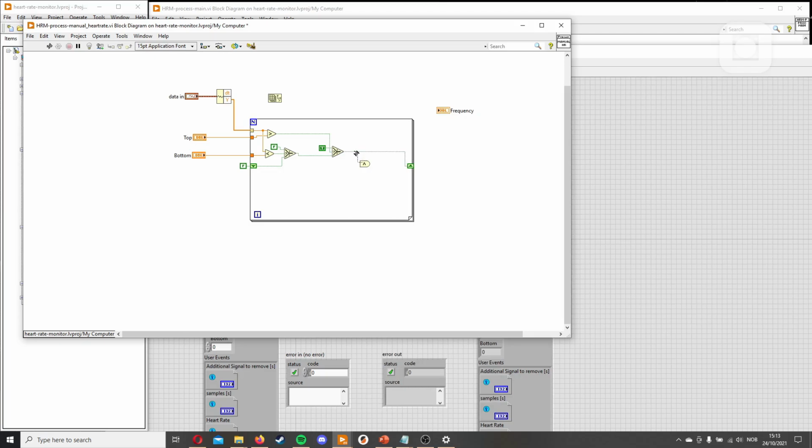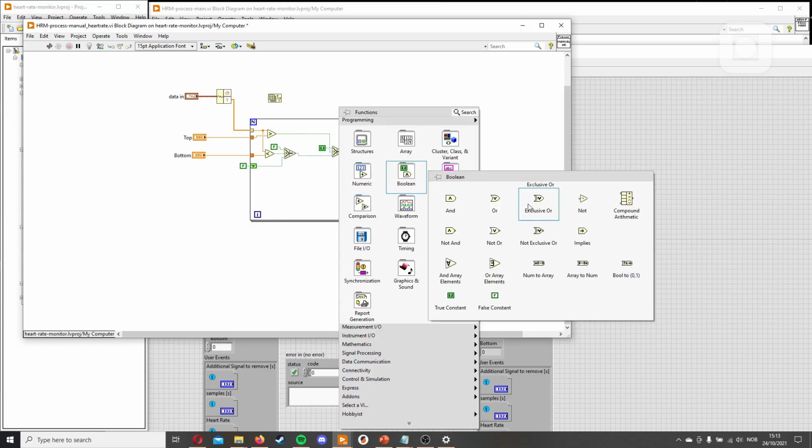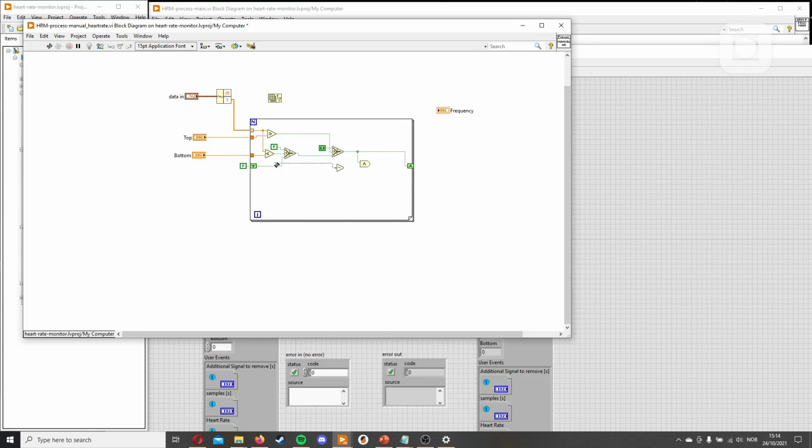So we'll say when this is high and when this is not high. So this will only trigger, as I previously stated, when this is low and this is high. This will only happen when this is being crossed. It will not happen when it's being crossed to the lower, because then it will be false here, and this will be high, and this will be true, and this will then be false. But now it will happen when this is false, which means that the previous was false, and this is high.